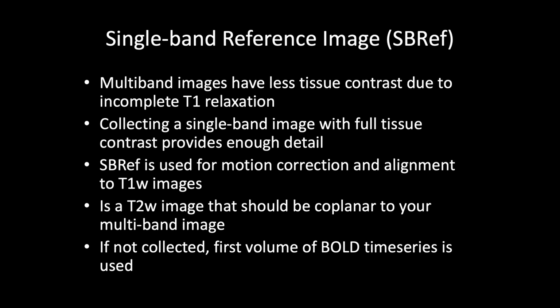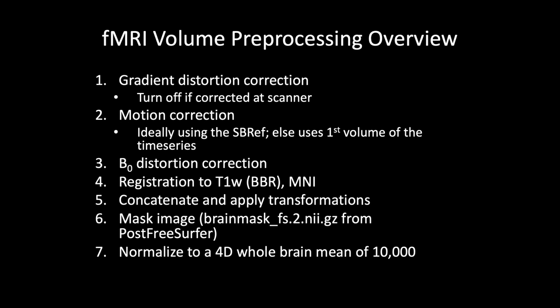So Amanda, when you collect your, on the MR 750 design, we do acquire single band images. You have to do that to reconstruct the multiband. Do you just put it... So we haven't, for you, or are those embedded within the multiband? They can be, or depending on which protocol you're using, they're either done as a separate scan or they're embedded. I don't think we have a separate scan. We do not have access to it, that I know. So would you want to have those images? Eventually. Yeah, I mean, we're in the middle of our study, so we started this, I don't think that was an option. Okay, let me check on that. Yeah. Okay.